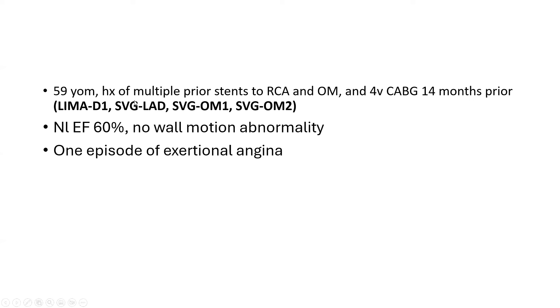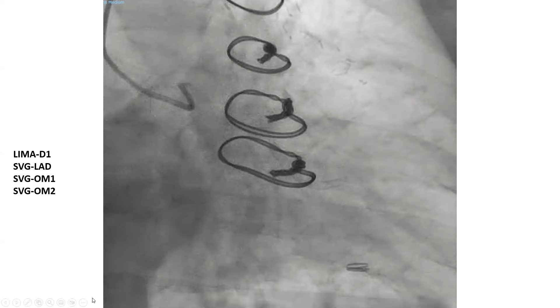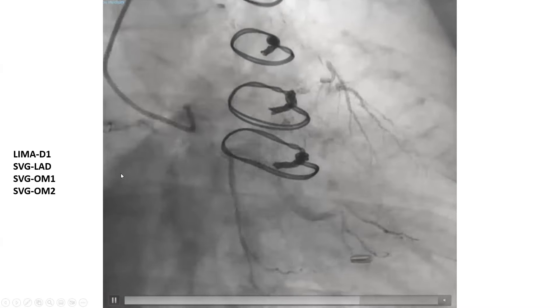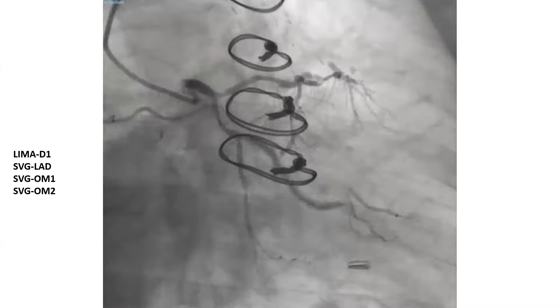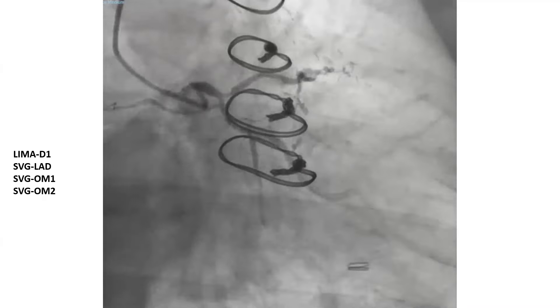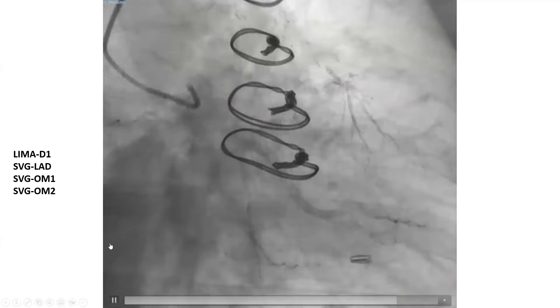This is a 59-year-old man with multiple prior stents to the right and OM, and he has four-vessel CABG: LIMA to diagonal, vein graft to LAD, vein graft to OM1, and vein graft to OM2. This is his angiogram starting with the native angiography — an RAO caudal view. Look carefully: you can already tell whether the vein grafts are patent or not just by looking at this angiogram.